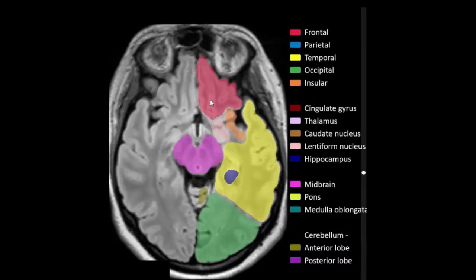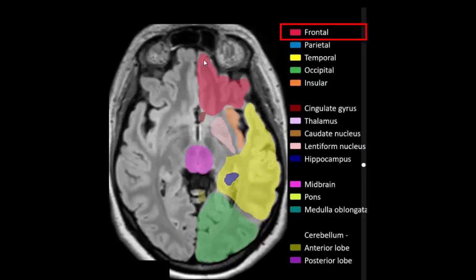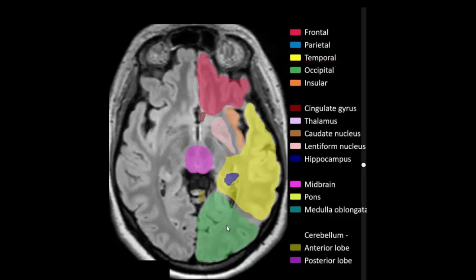Frontal lobe, temporal lobe, hippocampus, occipital lobe, anterior lobe of cerebellum, midbrain, insular cortex, lentiform nucleus. Frontal lobe, temporal lobe, occipital lobe, anterior lobe of cerebellum, midbrain, hippocampus, insular cortex, lentiform nucleus.